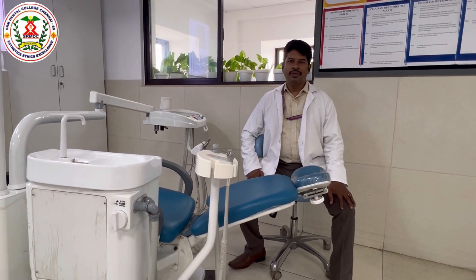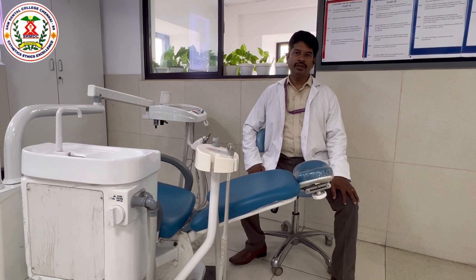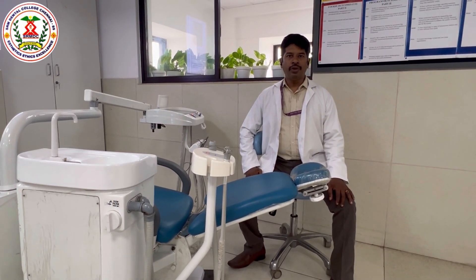Good morning all. This is Dr. Koush. Today we will see a video on chair positioning for scaling and positioning.